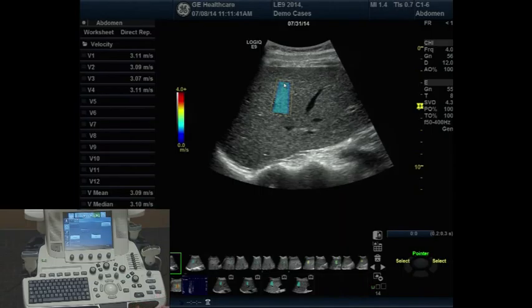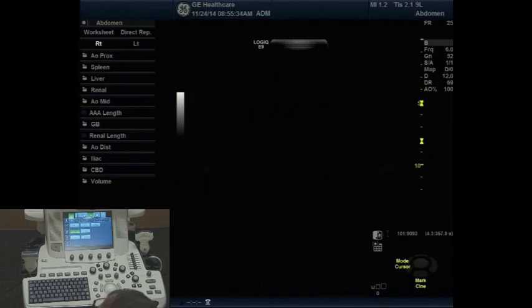Again, that's the liver case. The breast case will be very different. That is typically the case where you're looking for individual lesions. All right, so now I will explain how to use the 9L with shear wave elastography.